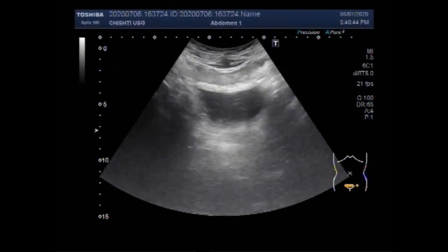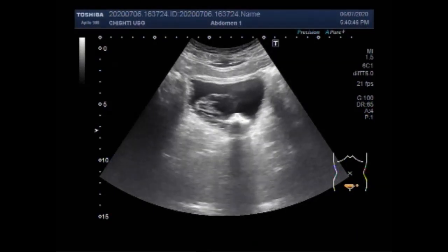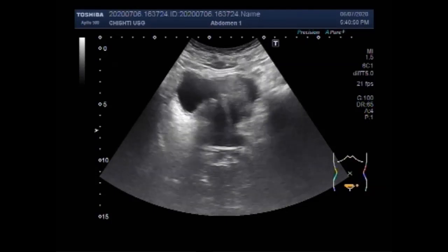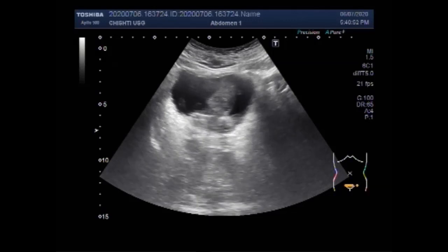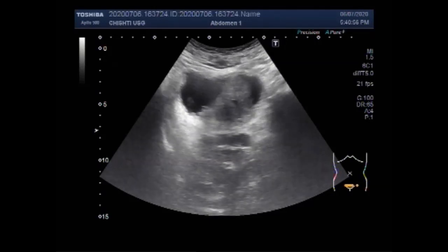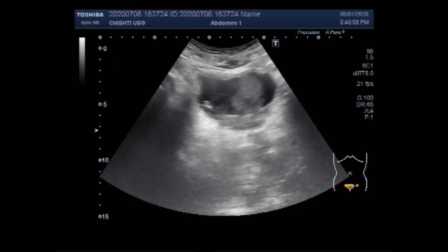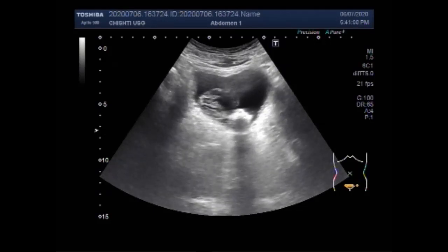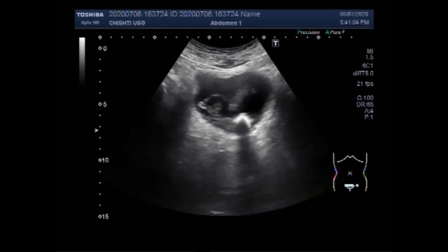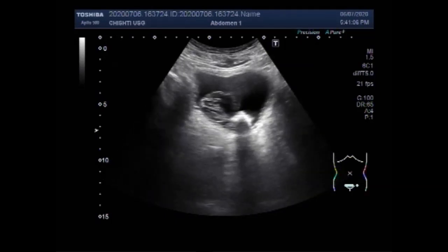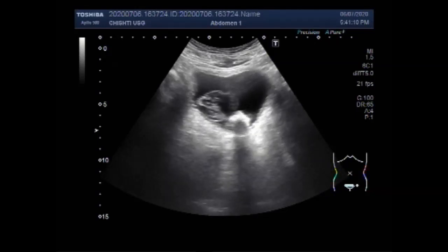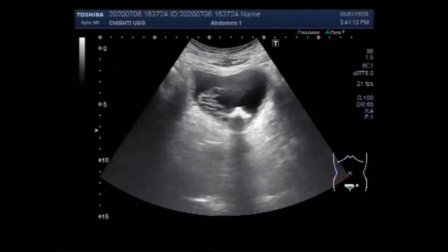Dear viewers, I hope you are all fine. This ultrasound video shows multiple findings in the urinary bladder including benign prostate hypertrophy, vesicle growth, and a large vesicle stone. I feel sorry for the patient, but this is the best video for teaching purposes because all three of the most common findings in the urinary bladder are seen in this video.